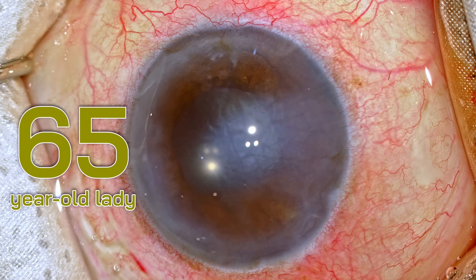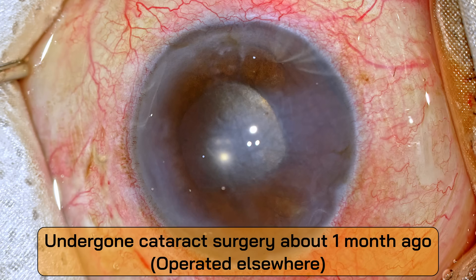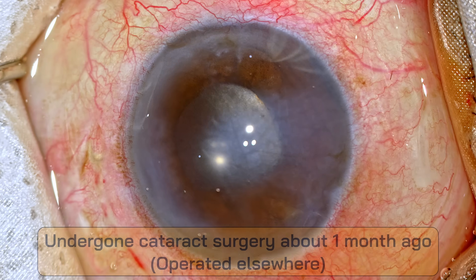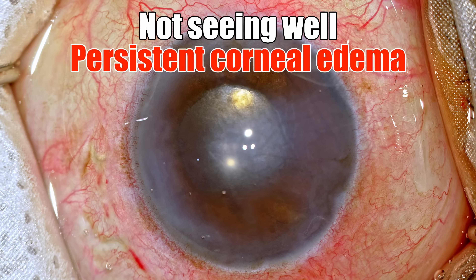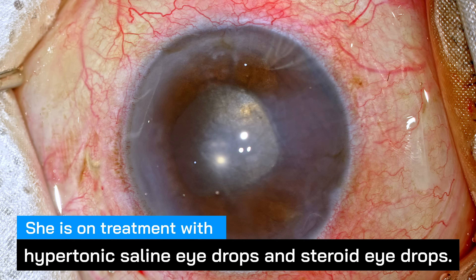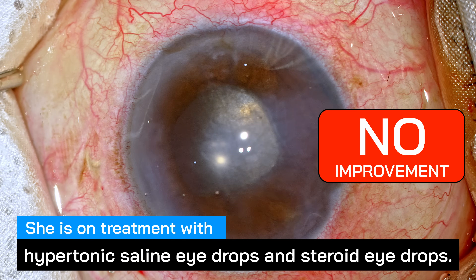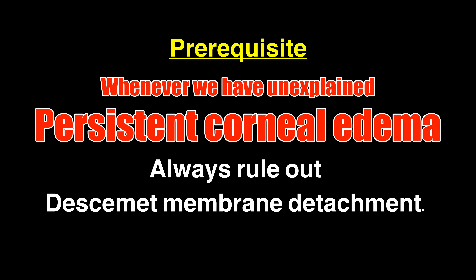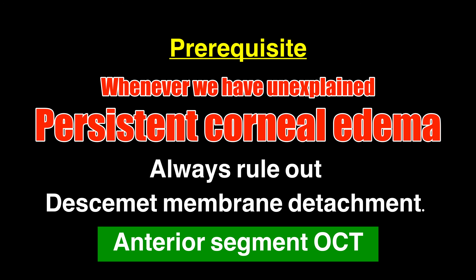She's a 65-year-old lady who has undergone cataract surgery about a month back somewhere else and she is not seeing well, the reason being persistent corneal edema. She's on treatment with hypertonic saline eye drops and steroids but nothing is improving. The first message from this case: whenever we have unexplained persistent corneal edema, always suspect Descemet's membrane detachment. The best way to look at it would be to do an anterior segment OCT.